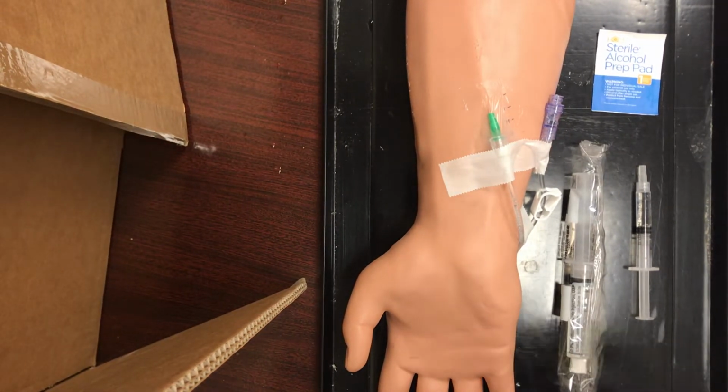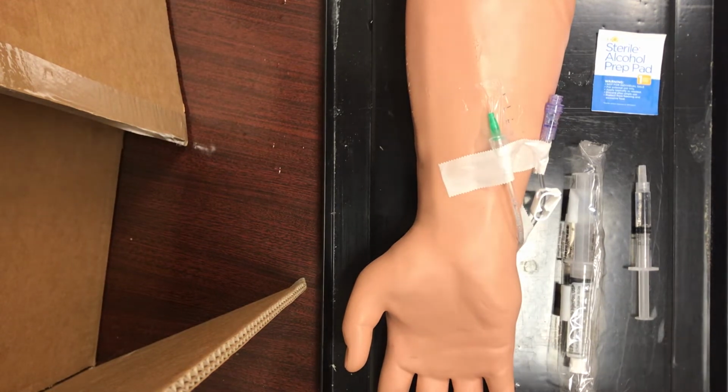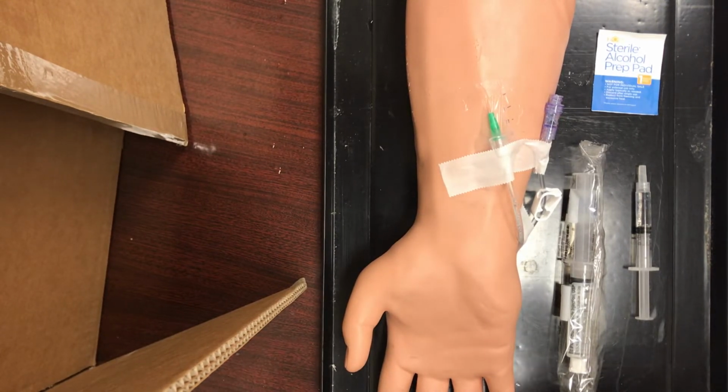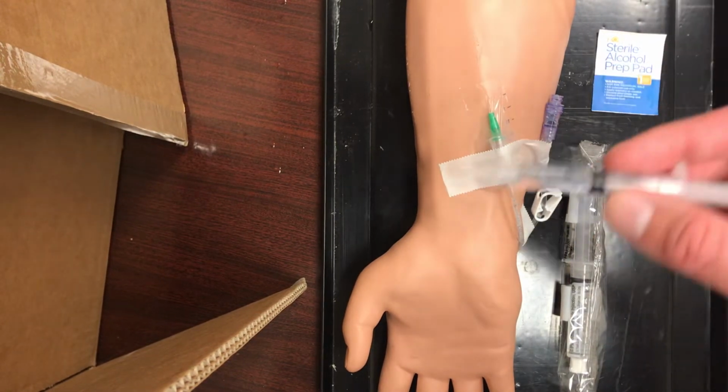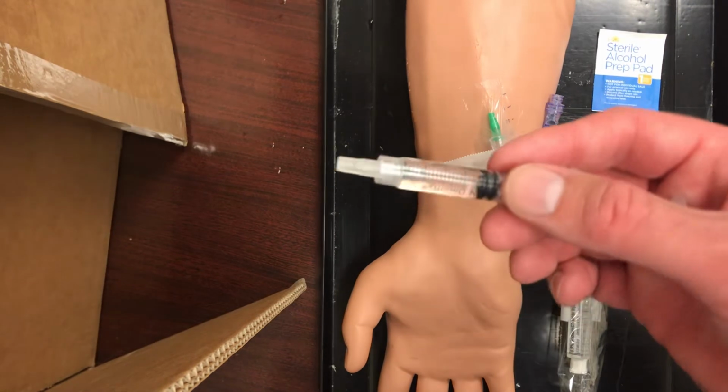So, we've checked our medication the first time. Typically, we'll do that at the Pyxis before we enter the patient's room. Now at bedside, we're going to go ahead and do our second check. When we have our medication, like I said, this is already drawn up. We want to go ahead and make sure we're going to administer this at the correct rate.